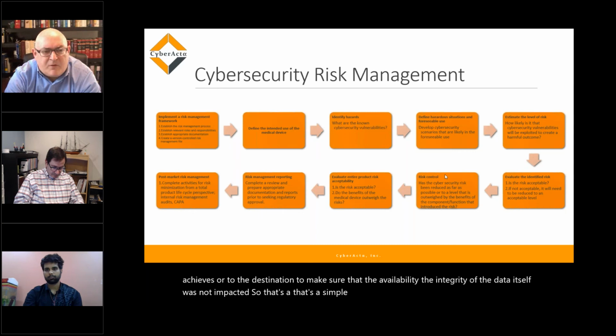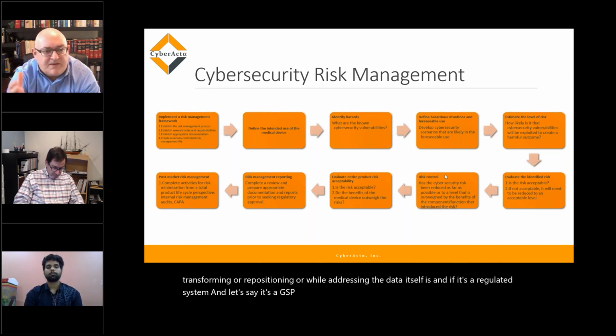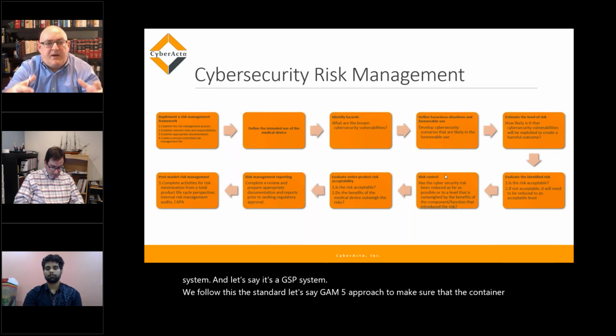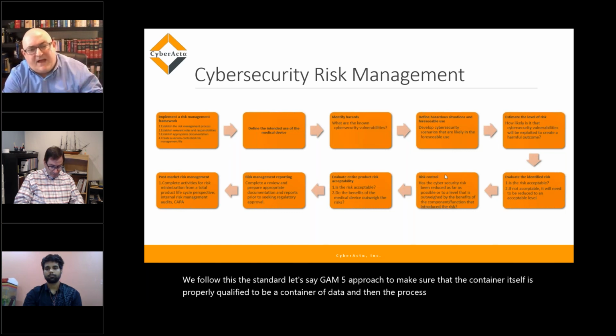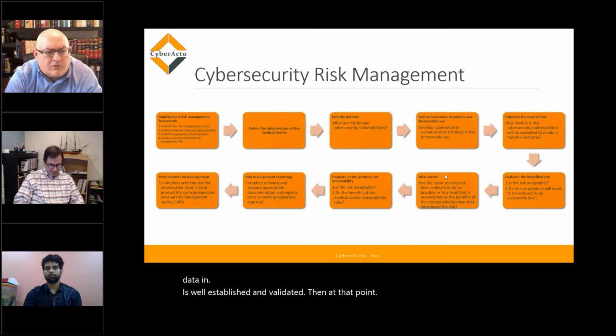The other part is really if we're not transforming or repositioning the data itself, and it's a regulated system, and let's say it's a GxP system, we follow the standard, let's say GAMP 5 approach to make sure that the container itself is properly qualified to be a container of data, and then the process itself for bringing the data in is well established and validated. And then at that point, you do a hashing protocol to demonstrate that the integrity of that data itself was not impacted.